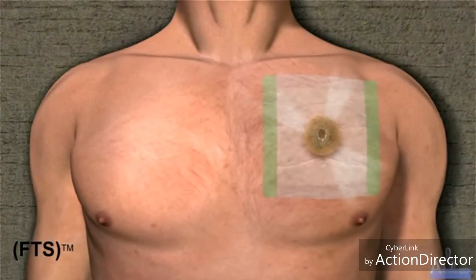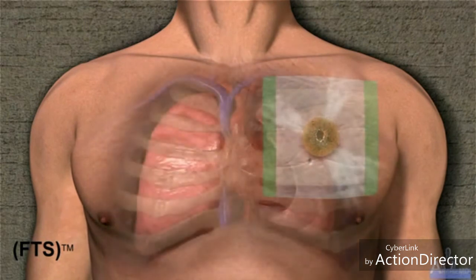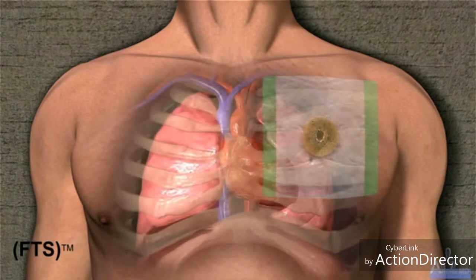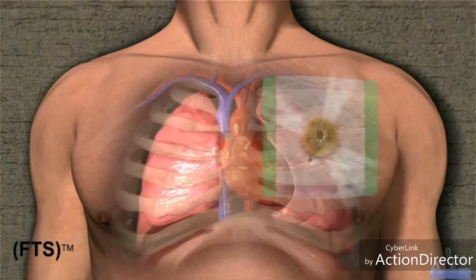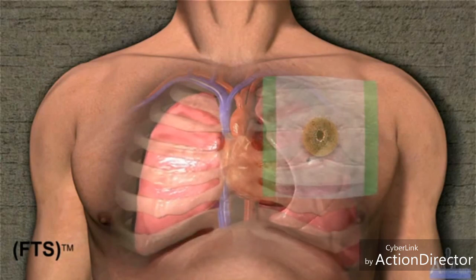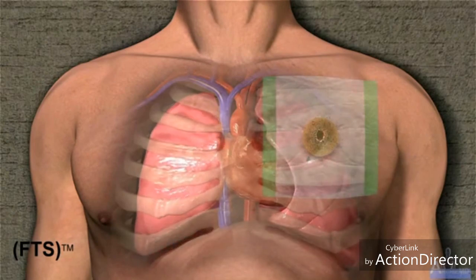The one-way valve is designed to release air pressure that may build up in the thoracic cavity and reduces the need for manual venting or burping. A correctly placed FTS should vent an open pneumothorax and prevent development of a tension pneumothorax.